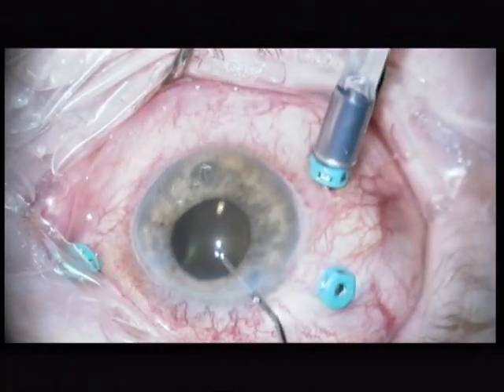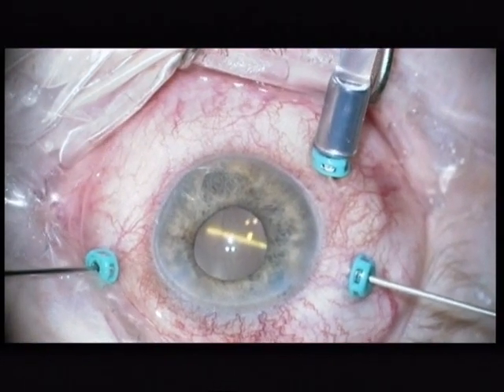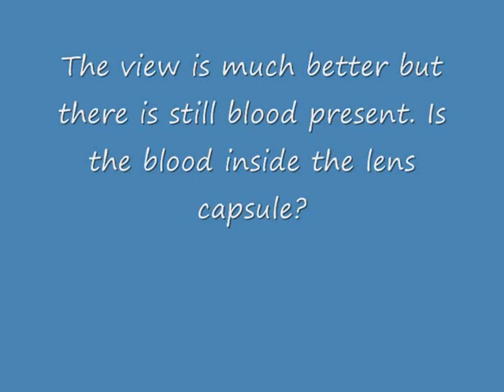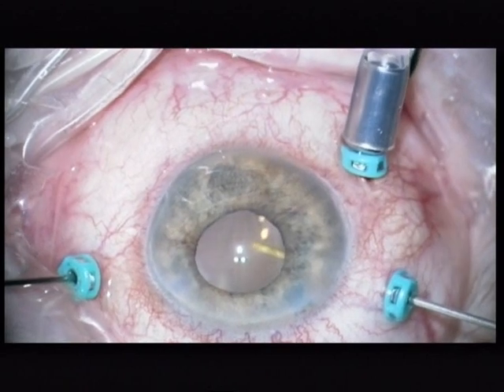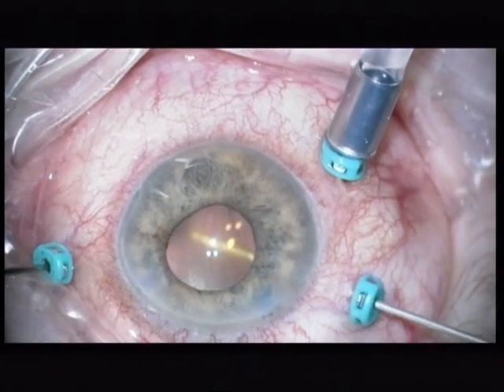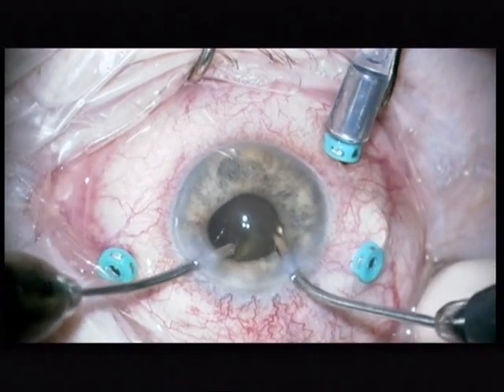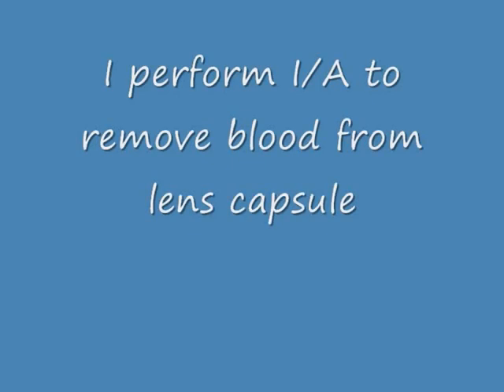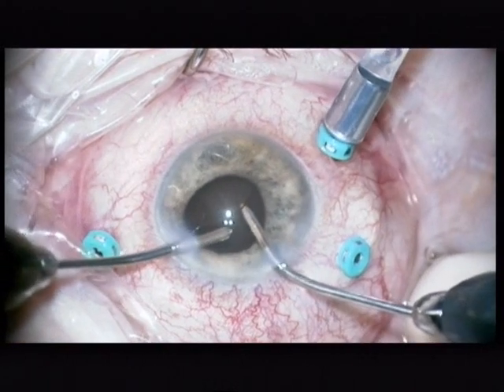I am now injecting BSS to improve the view. But you can still see that the vitreous cutter is very difficult to visualize. So, the question is, where is the blood? Is the blood maybe inside the anterior chamber, inside the lens capsule? I decide to repeat irrigation aspiration and remove blood from inside the lens capsule.